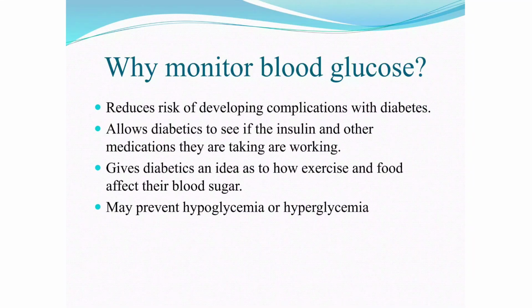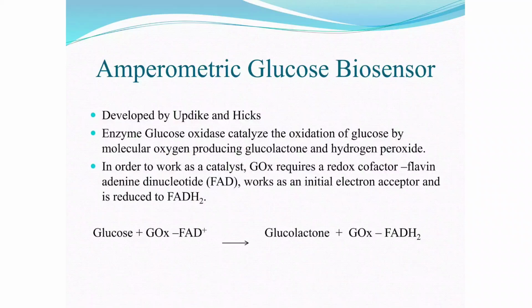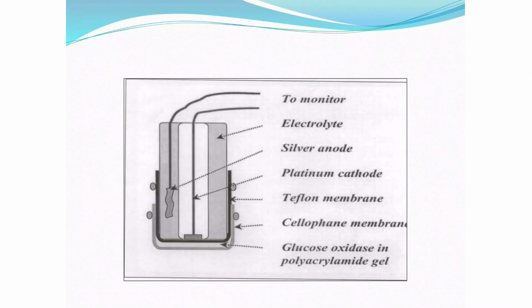And next is the enzymatic architecture of the lactate sensor. Here the operational design is chemically analogous to the glucose sensor, and it uses lactate oxidase.